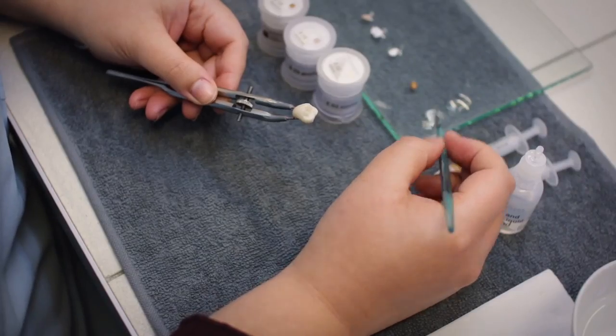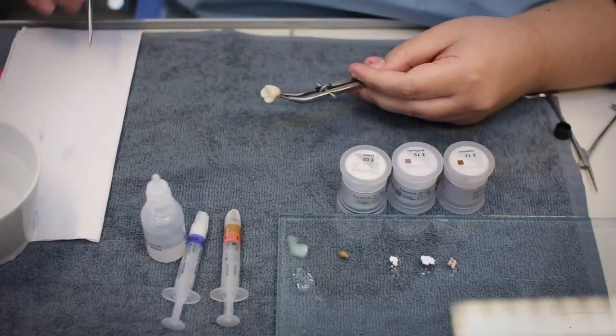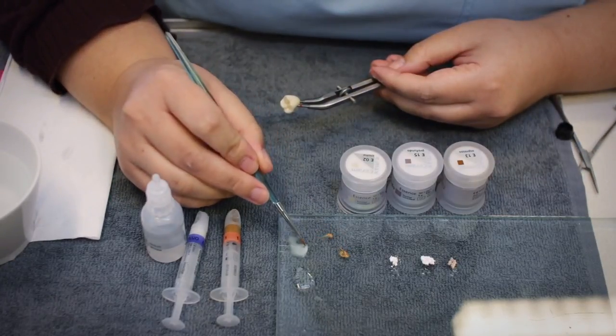Glaze is applied over the entire crown. A darker shade of glaze is used on the cervical third and a light fluorescent glaze on the incisal third.